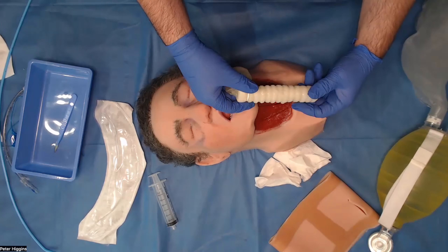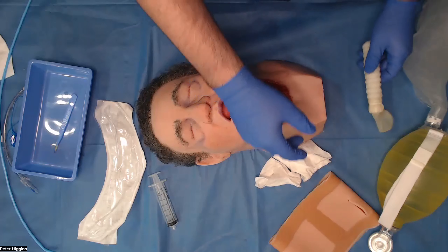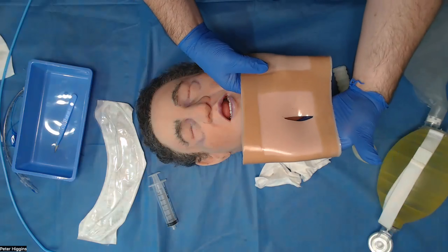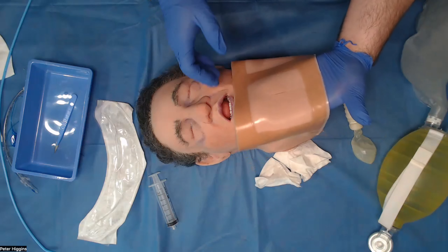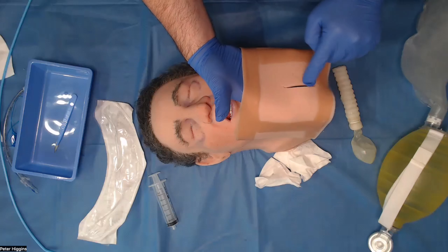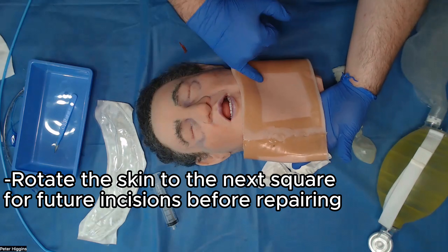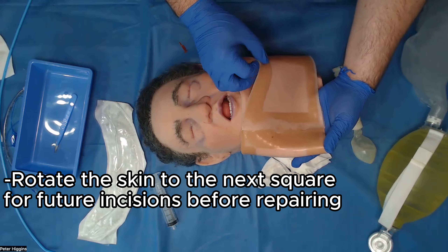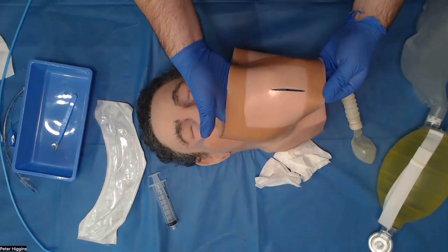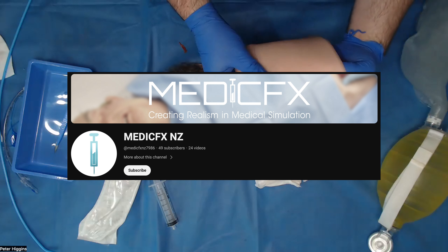You can also continue to rotate the trachea around further and further, so you can get multiple attempts on a singular trachea. The same with the neck skin — it's done in segments and sections. As mentioned in the setup video, just ensure that this square here is in the middle of where your participants are likely to make that incision. All you'll need to do is rotate the skin round to the next available square, meaning you'll get at least three goes out of each skin before you have to consider repairing them. The repair videos are on our YouTube channel, so please go and have a look at that.